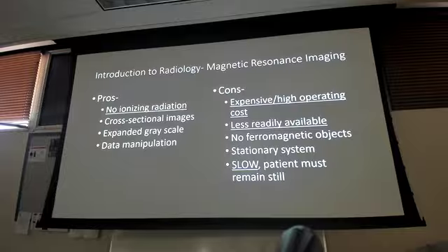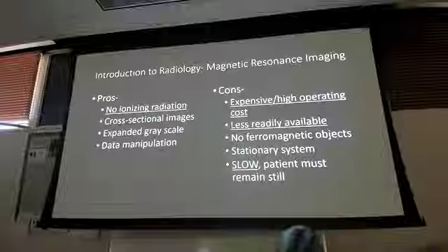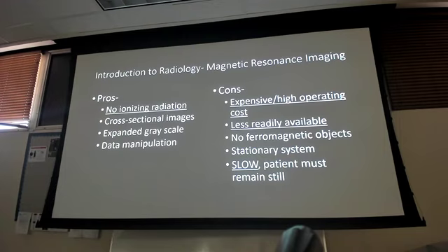So they have a huge questionnaire too that they ask all the patients who are getting an MRI. Like, do you have any piercings that are not removable? Do you have a pacemaker? Is it safe? Most pacemakers nowadays are MRI compatible, and the patients have a card for that. Do you have hip replacements? Again, nowadays most of them are titanium, so they are able to go into MRI scanners. A lot of this stuff is already going to be safe, but they ask the patient all these questions and do a pretty thorough screening before they even do the scan.